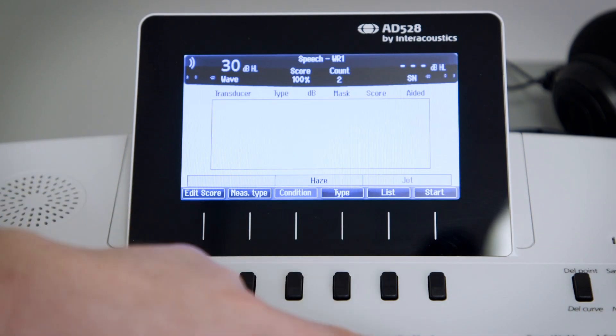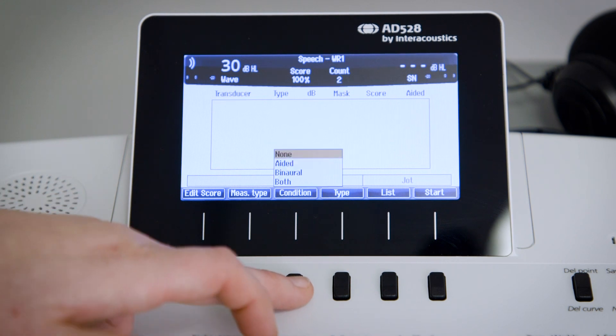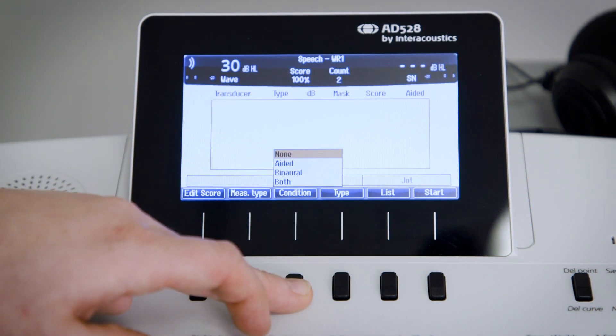The condition key can be used when you are in free field for setting the aided condition, you can use it binaural so that you present on both ears, or you can do it where it is both aided and binaural.